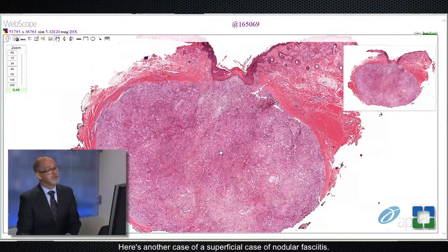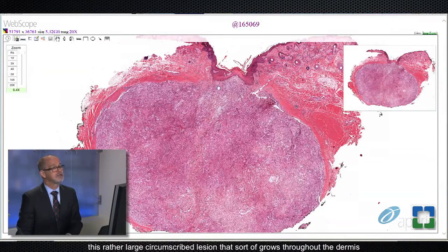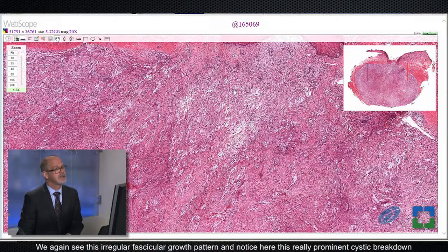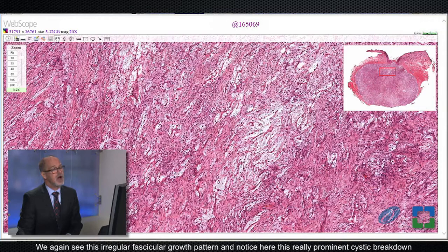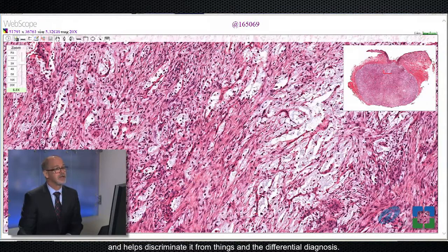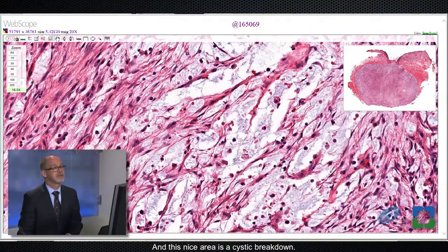Here's another case of a superficial nodular fasciitis. This one arose in the chin of a young woman, 27 years old. Here we can see this rather large circumscribed lesion that sort of grows throughout the dermis and even extends into where the subcutis would be. At higher power, this one is a little more classic for nodular fasciitis. We again see this irregular fascicular growth pattern. Notice this really prominent cystic breakdown where the tumor cells sort of fall apart — this is a really helpful and diagnostic feature for nodular fasciitis. We have these same bland spindled cells with open chromatin pattern and feathery elongated cytoplasmic processes, and nice areas of cystic breakdown.